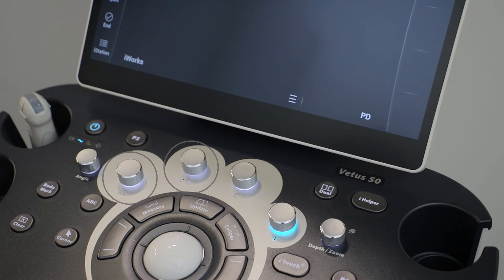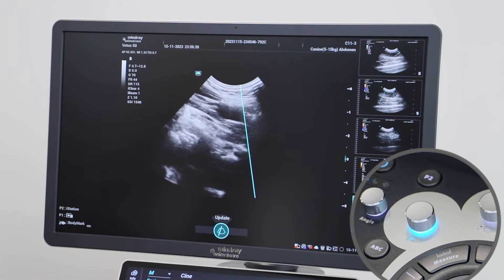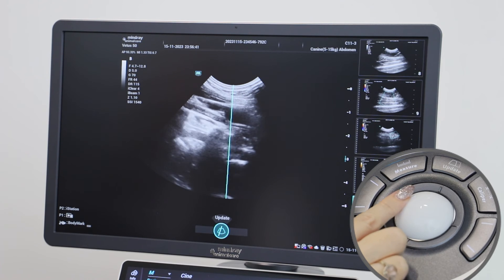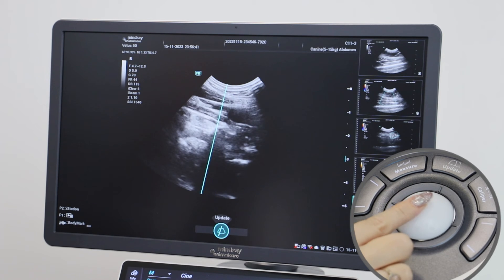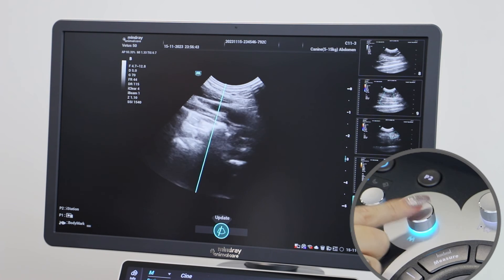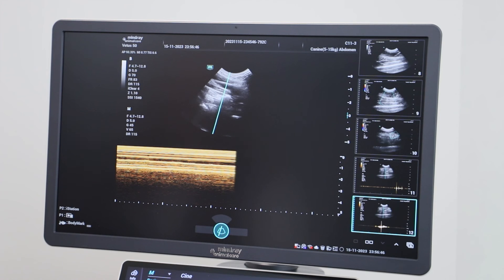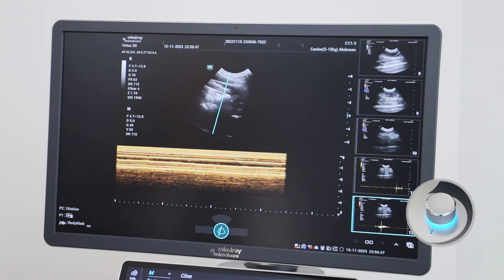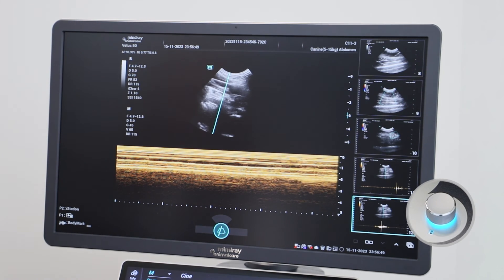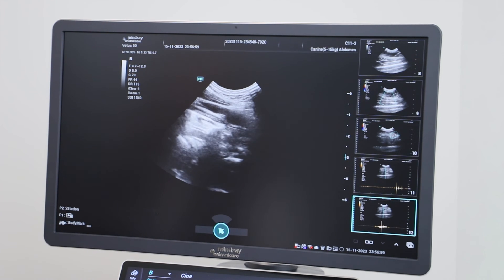With both M mode and pulse wave Doppler, click once on the button to set your cursor and then click the same button again to form your trace. Click on the B mode button to exit any of these additional modes and to return to your original scanning screen.